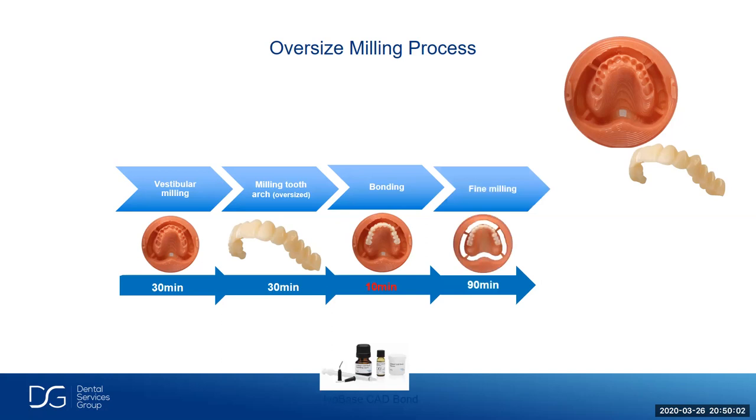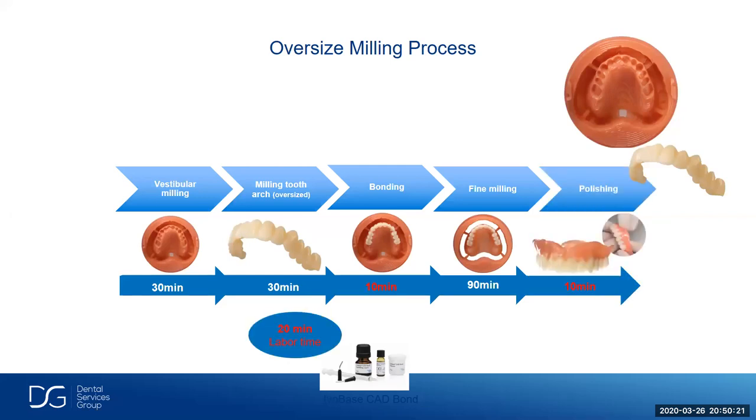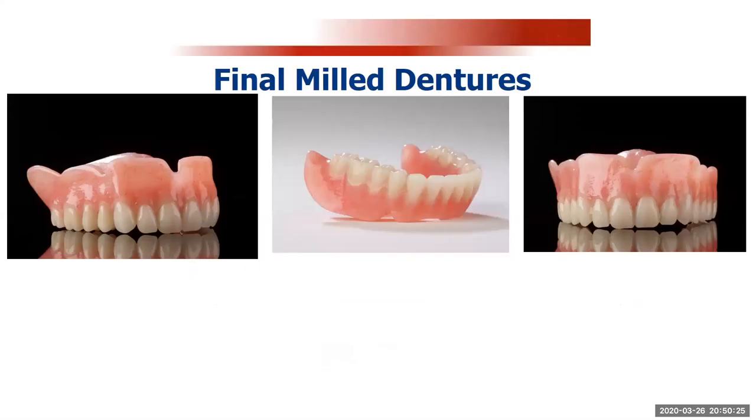Once the fine milling is finished, this denture is all finished and just ready to polish. It comes out of there just looking like a finished denture. So all we have to do is polish the material and that's it, it's finished. It makes life a lot easier for us on the dental laboratory side, but it's also giving you a nice aesthetic and good fitting denture. About 150 minutes of total milling time.